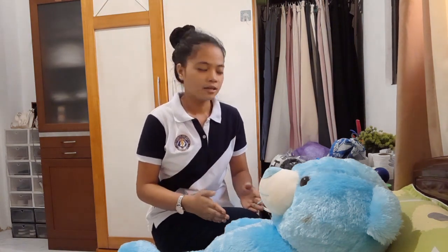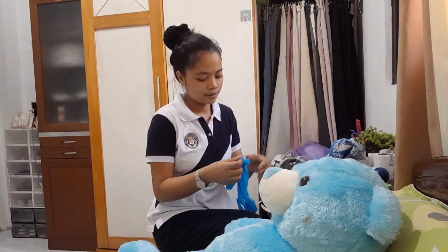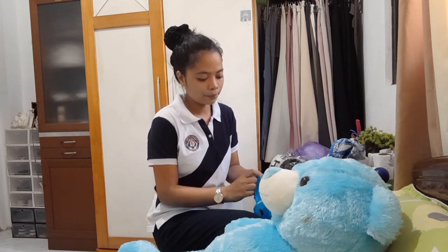Then, next is to provide for privacy. So, by draping the client or by closing the window, the door, I mean. Then, explain the procedure to the client. Then, perform hand washing thoroughly. Then, don appropriate PPE.